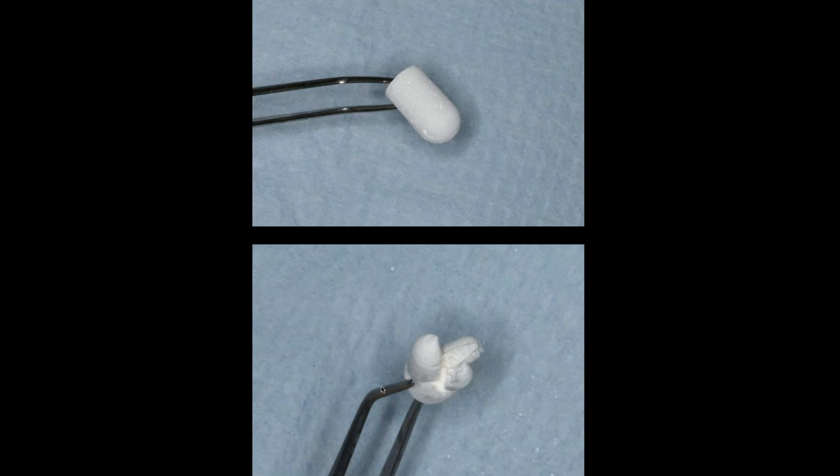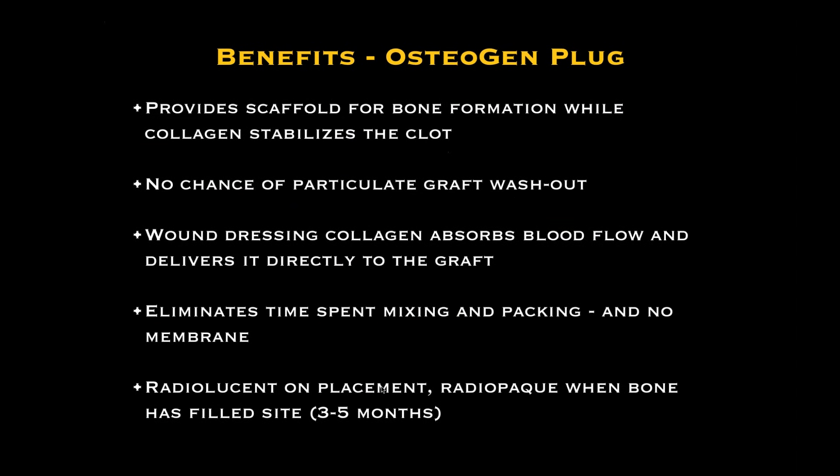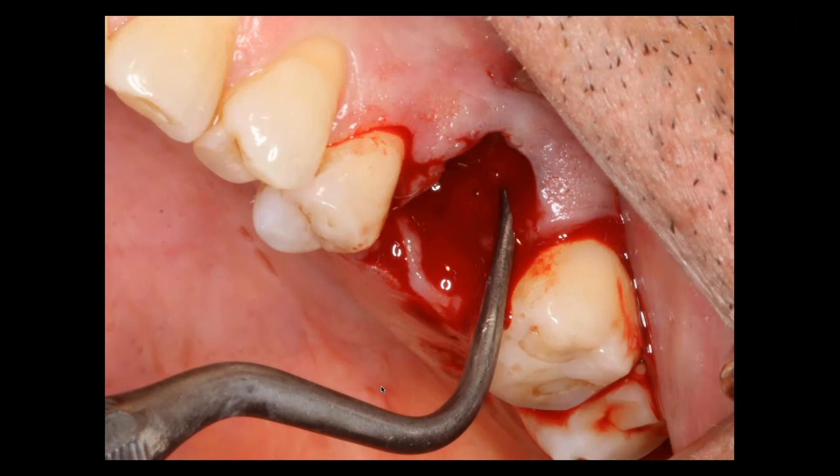You can see I actually cut it to make it look like the root of a tooth. We cut it so we have room for the palatal, mesial facial, and distal facial. And as I said, it provides a scaffold, it absorbs blood, we don't have to mix it with anything, and it's very cost effective. And within a three- to five-month period, you will get complete conversion of this material to bone.